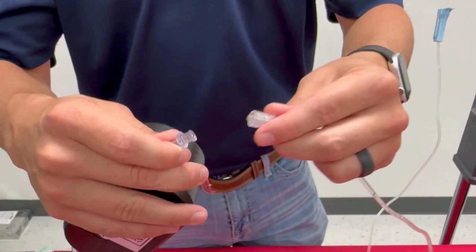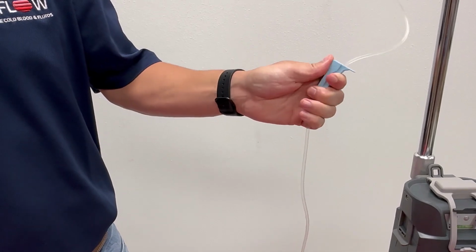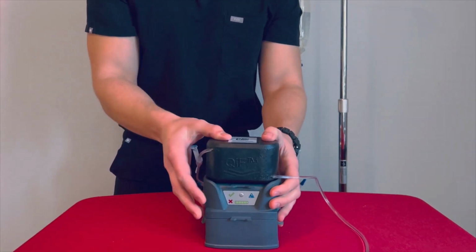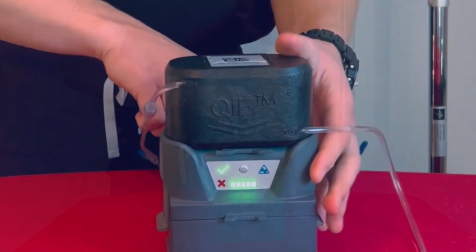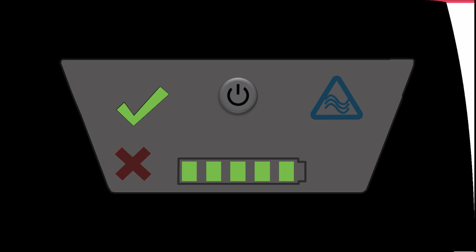The assembly and operations are done in 2 simple steps. First, connect the IV tubing to the CDU and flush it. Then, connect the CDU to the base unit. The unit will be activated automatically once the CDU is in place, and warm fluids will flow within just a few seconds. The LED indicators on the Warrior Lite will indicate the status of the warming process.